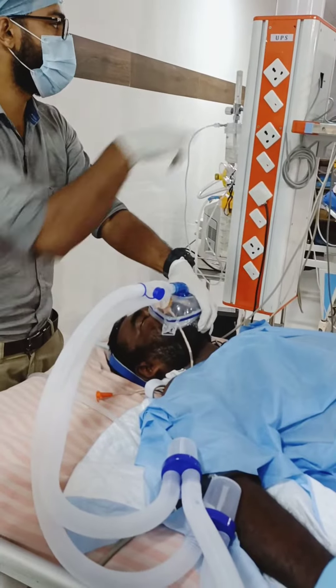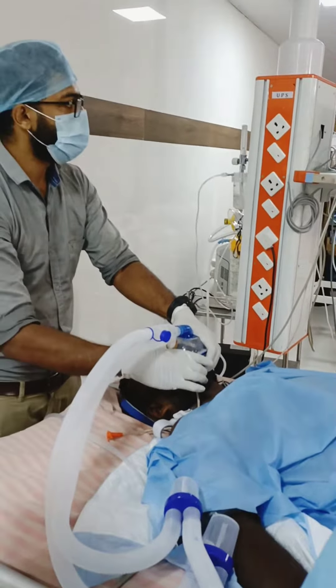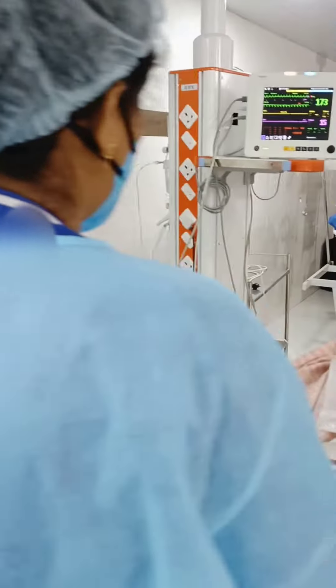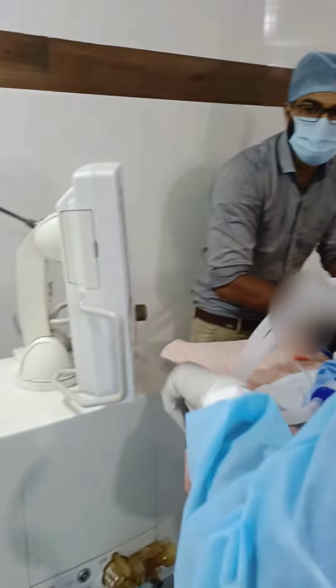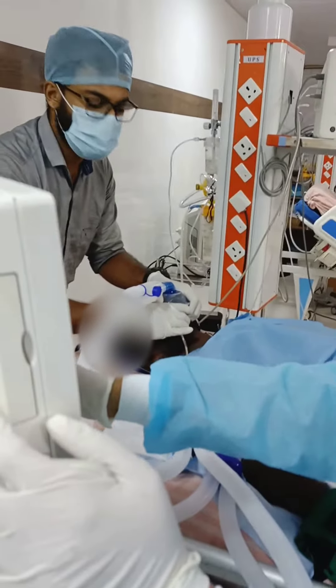We have given a paralytic agent and sedation. The patient is already on NIV. I am taking advantage of it while the paralytic agent sets in.